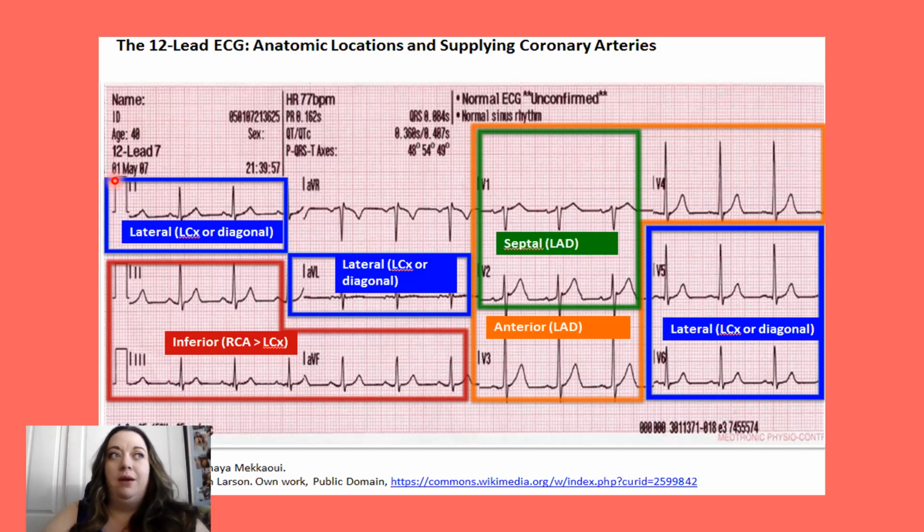So, okay, we drew troponin. All right, it's been 30 minutes. Her labs are starting to come back. Let me check it again. And it might be no ST elevation, but then we have our elevated troponin. So those are what we call non-STEMIs, or an N-STEMI. Have you guys seen that before? So it's a non-STEMI, meaning there's no ST elevation, but it is still a myocardial infarction.